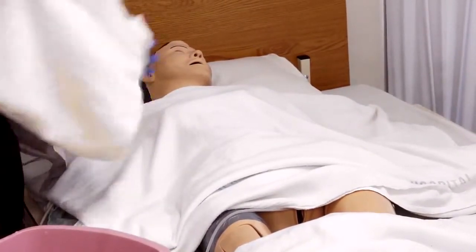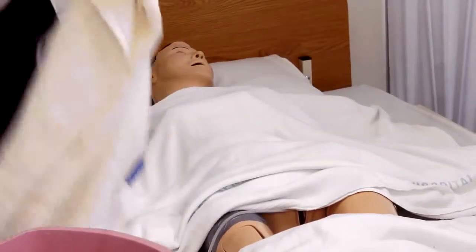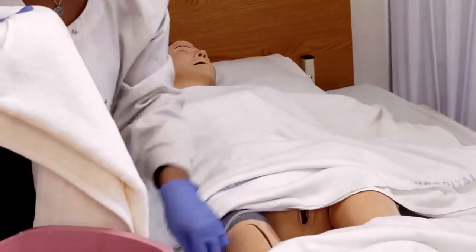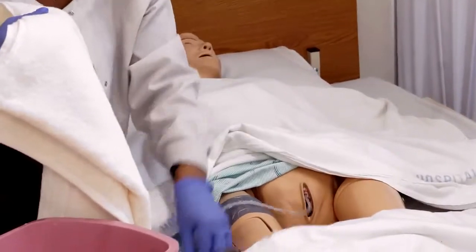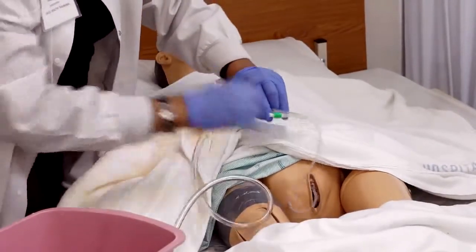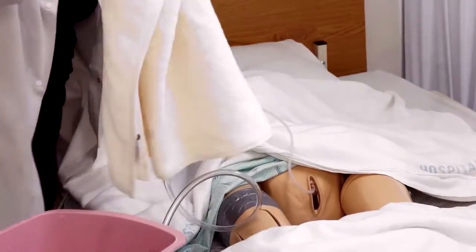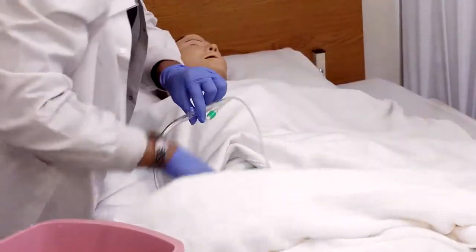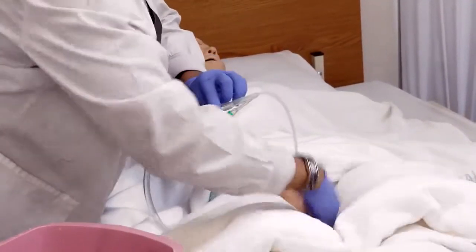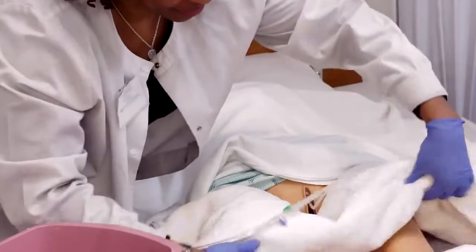Okay, we do our towel, the same fold as peri, fold it in half. Fold it in half one more time. Put the flaps on the top. Now we just want to go ahead and gently pull the catheter back. We hold it at the connection piece. You pull it back. We want to make sure we have a little bit of a loop right there so we don't put any tension on the catheter. Go ahead and place that carefully just over the legs. Make a little indentation there, and we lay the catheter back down.